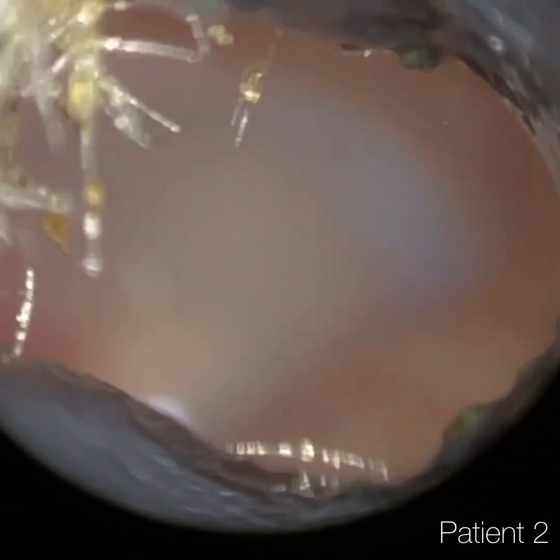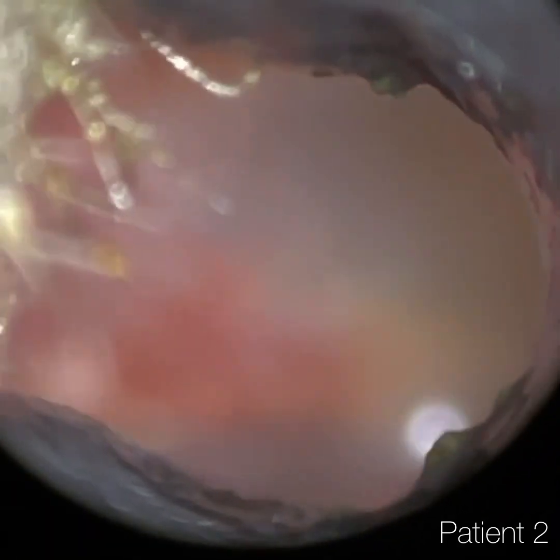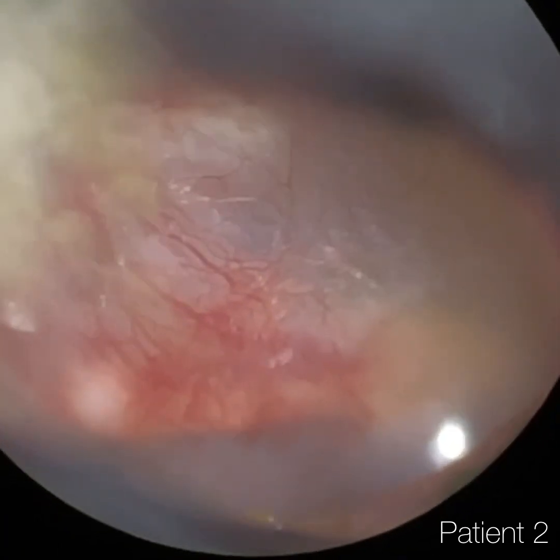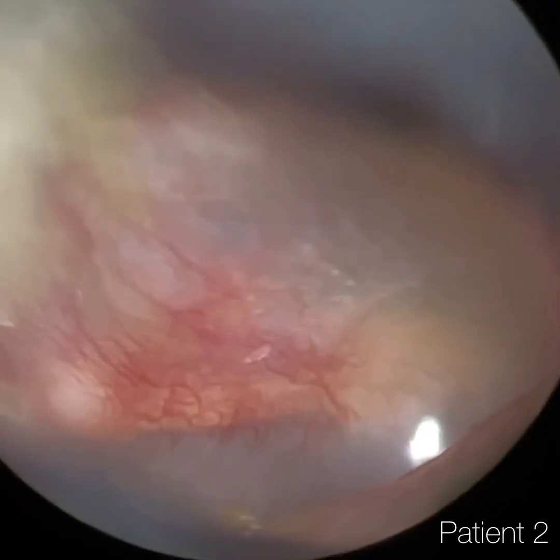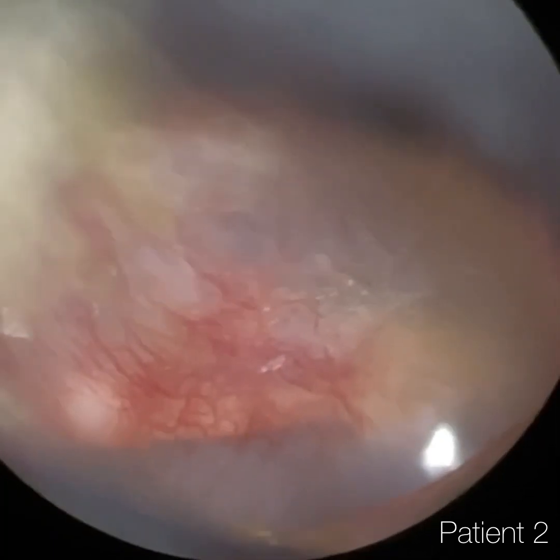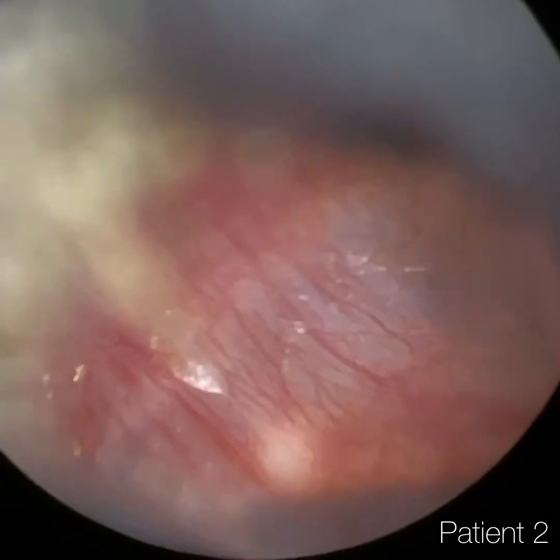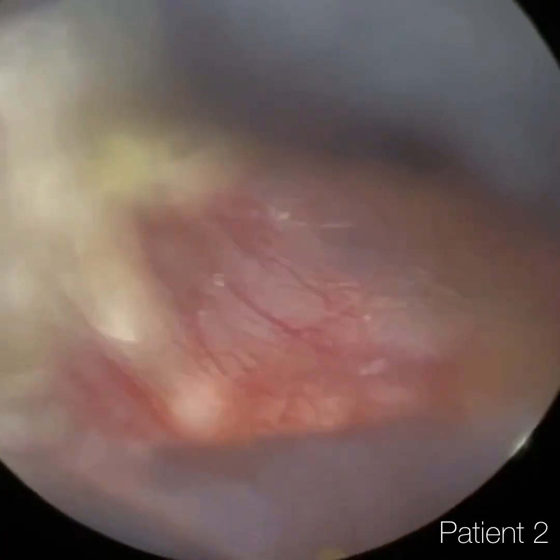So back into the ear. I'm going to straighten the ear canal, adjust the focus, and you'll see a lovely clear view of the patient's eardrum. You can see all the capillaries, the blood vessels. I'm going to have a look at the attic now, just to make sure there's no retraction. Stunning view of the eardrum.